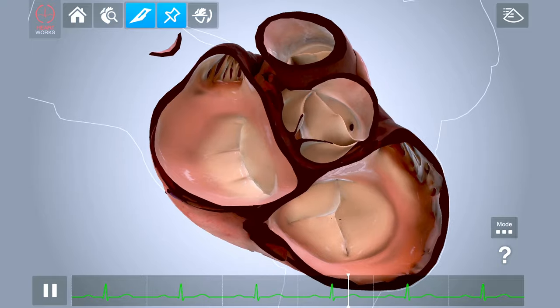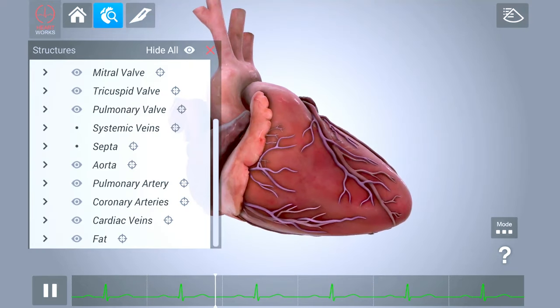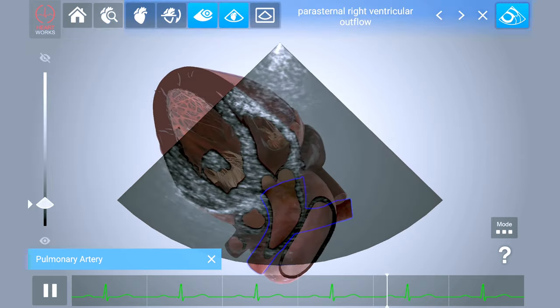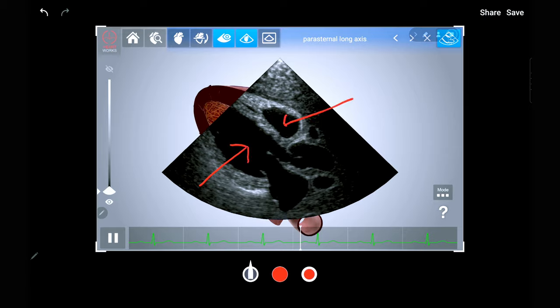There is a play and pause option with the user able to scrub along the corresponding ECG. Anatomical structures can be labeled in both the 3D heart and ultrasound images, and these structures can also be hidden. Images can further be annotated using the stylus.